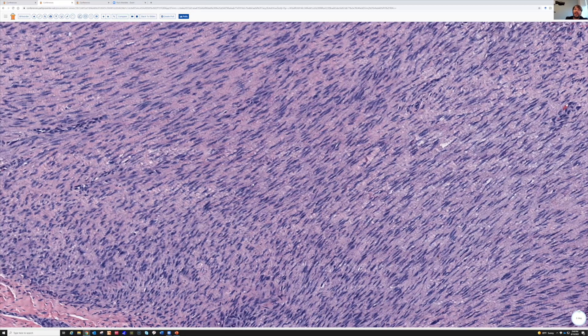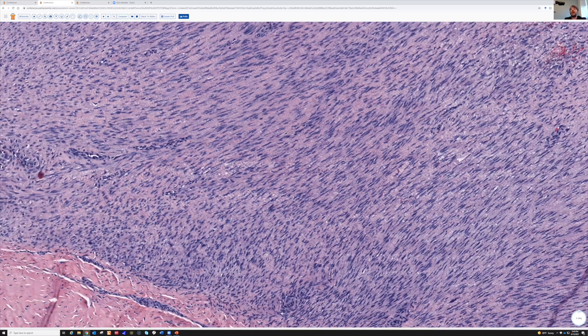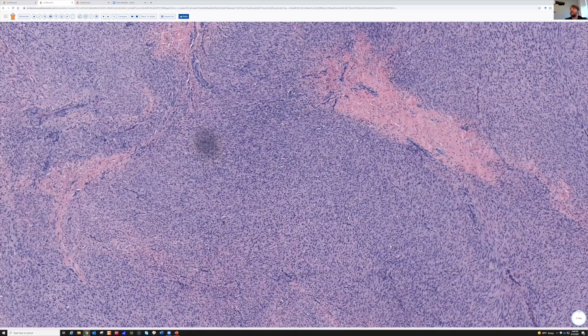Look how wavy they get. The fibroblastic tumors grow similar to dense regular connective tissue and they tend to get wavy like this as an artifact of processing. Also, you look at areas like this — that doesn't look like fascicles of spindle cells. That looks like a bunch of round cells.